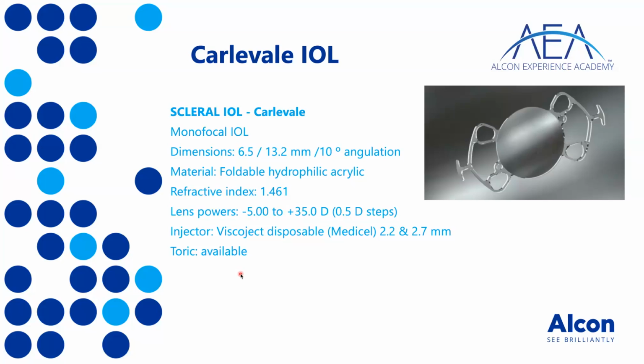So, having identified the issue, he came up with one of the brightest ideas ever, which was to eliminate this issue altogether. And this is the lens that he has created. The lens is a standard lens with this sort of V-shaped haptic, with this T-shape end of it. This one goes outside the eye through a small hole, and of course once it's out it opens up and keeps the lens in place. I'll show you a video about this.